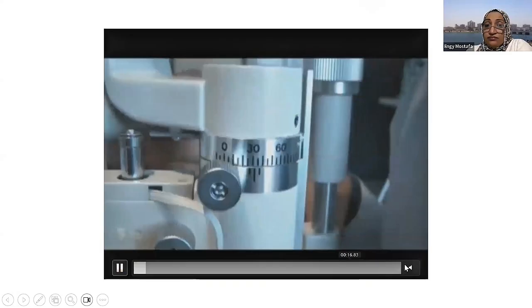Grade 4 is the open angle, where they are equal in size. If it is half, it is grade 3. If the AC darkish area is a quarter of the optic section, it is grade 2. And if it is less than a quarter, this is grade 1.